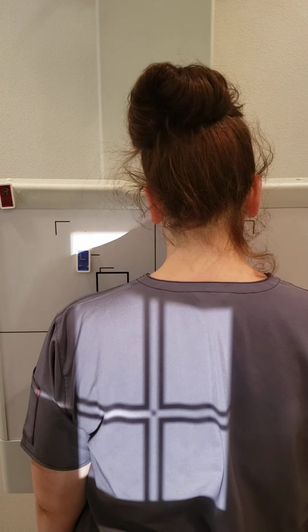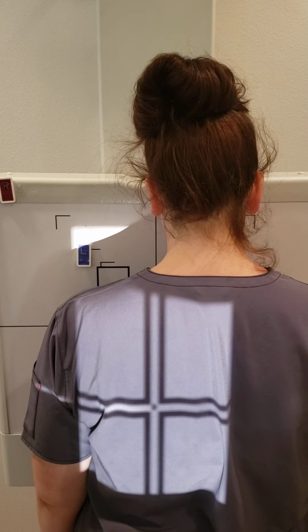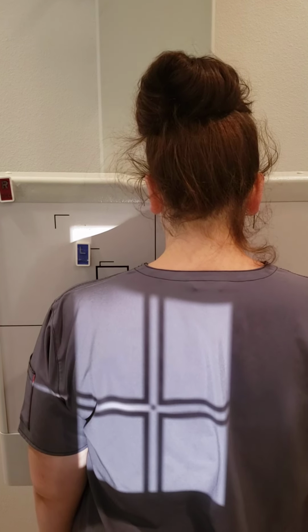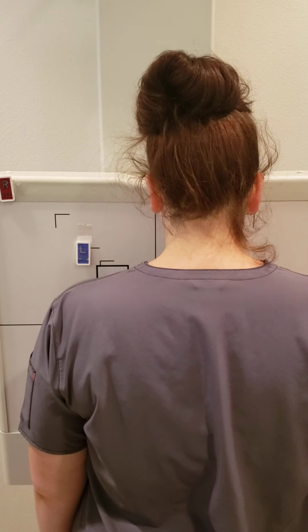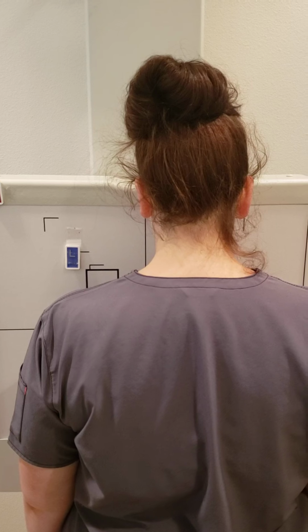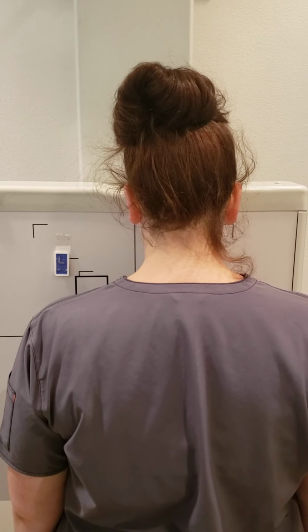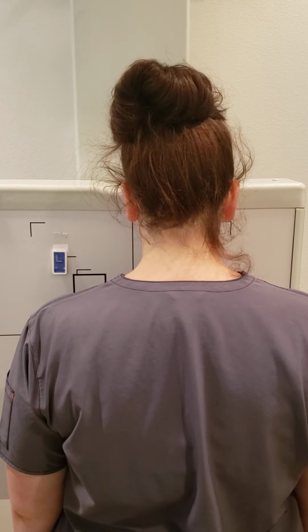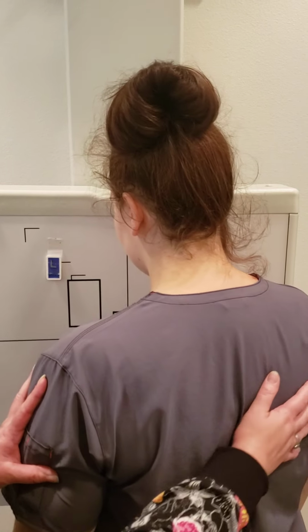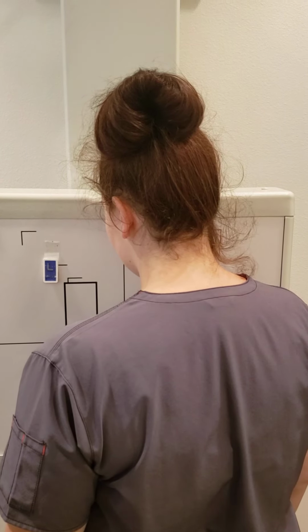And again, if we're doing upper ribs, it'll be on inspiration. If it's lower ribs, it'll be on expiration. So take a deep breath in and hold your breath, expose. You can breathe. Now when we're doing anterior ribs, we want to rotate the area of interest away from the IR. So since we're looking at left anterior ribs, this time we're going to do a 45-degree RAO in order to visualize the left side.